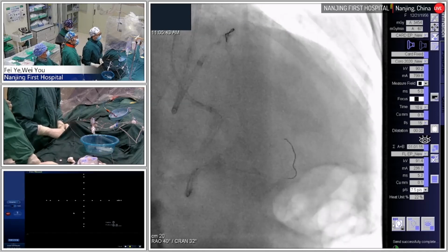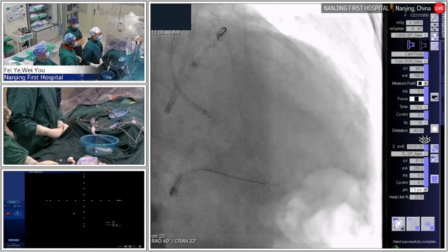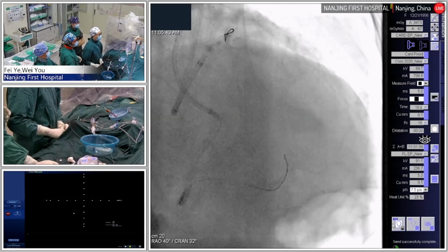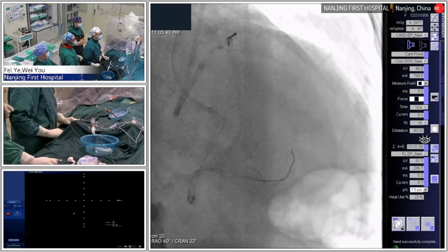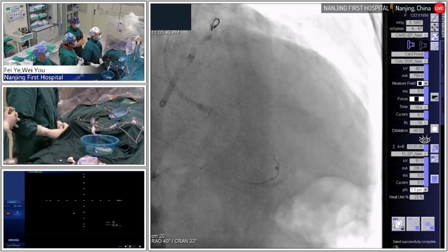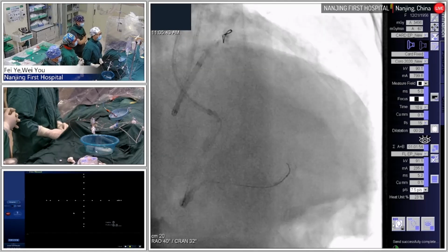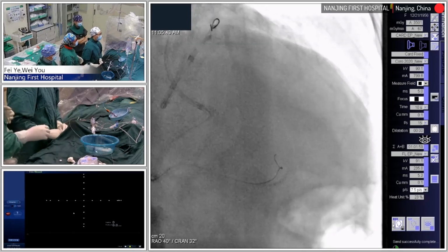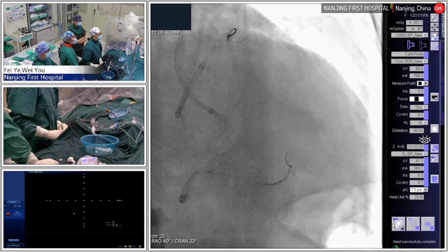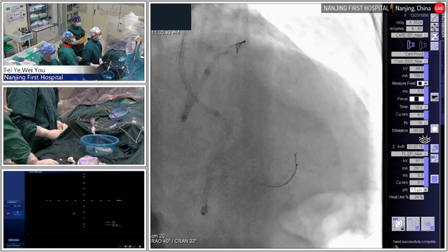If we want to perform a surfing technique, that means the CC grade was 0, so we cannot see clearly from the distal RCA to the LAD. We can try many times for different septals. Very tortuous for the septal. Another problem for this case is that we cannot see any collateral from the proximal part of the PDA. We also can find many small collaterals located at the distal part of the PDA. That's not suitable for the retrograde wire tactic, even if we use a surfing technique.